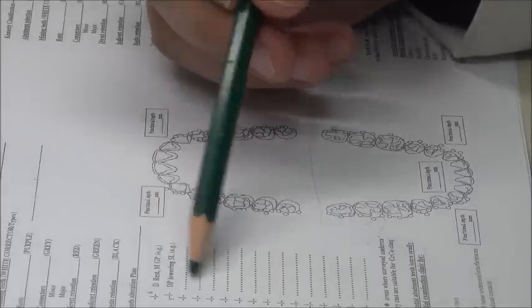I'm going to concentrate a bit on the tooth alteration plan because this is where major problems happen in the clinic for clinical students, fifth-year clinical students, when they're doing chrome cobalt. For example, after a full day, a full session of preparations, the patient goes home and the student says, I forgot to do an enamel dimple.